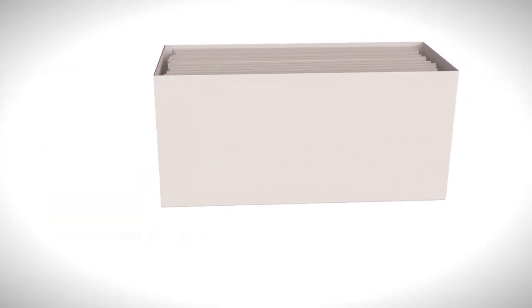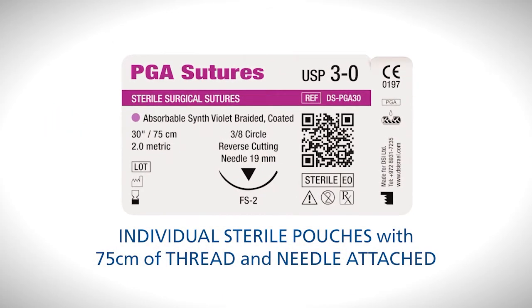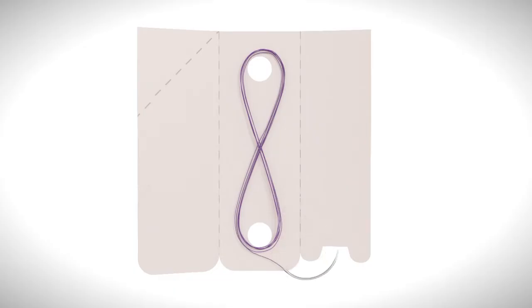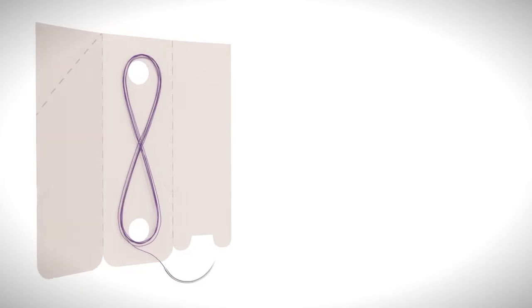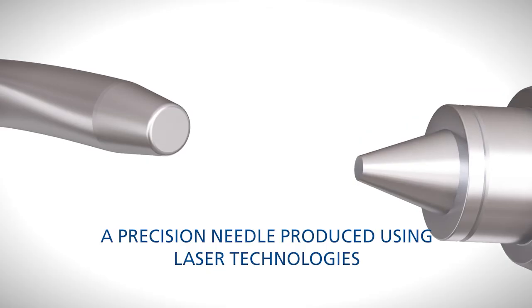Each suture comes in an individual sterile pouch with 75 centimetres of thread and needle attached. As every surgeon knows, the good needle is truly a game-changer. One of the biggest benefits of this needle is its precision. Produced using laser technologies, the needle is incredibly sharp and fine.